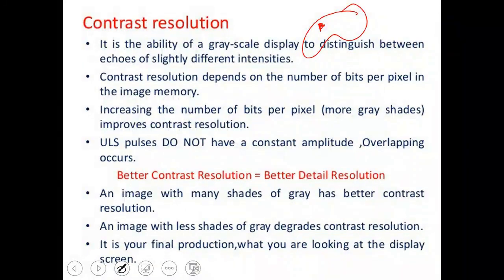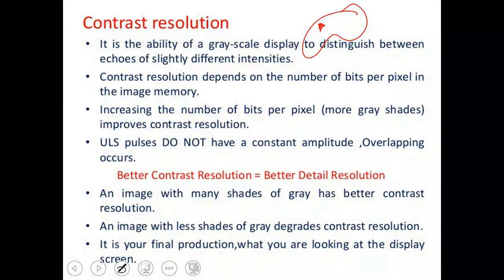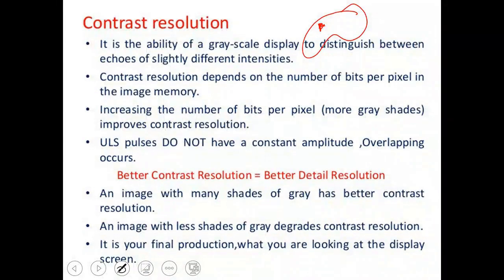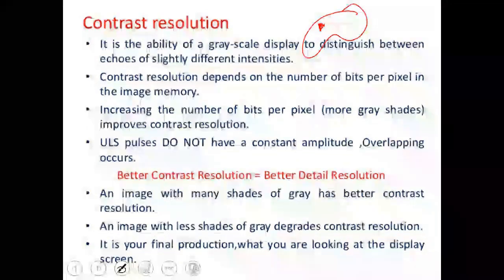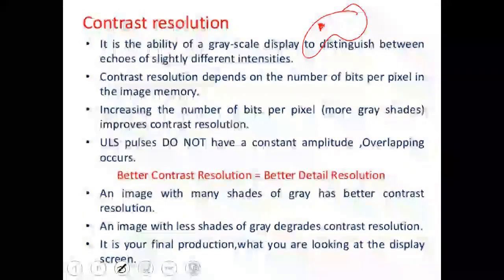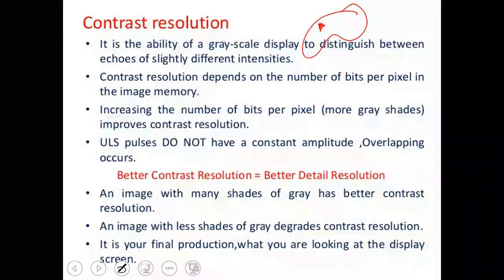I talk about the contrast between something high density and something low density.